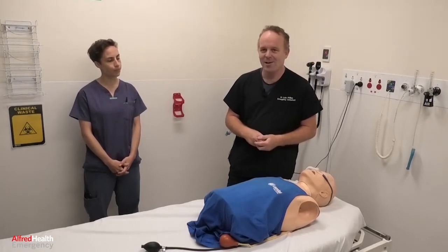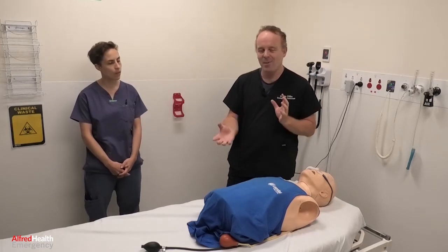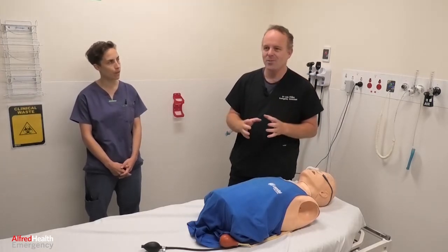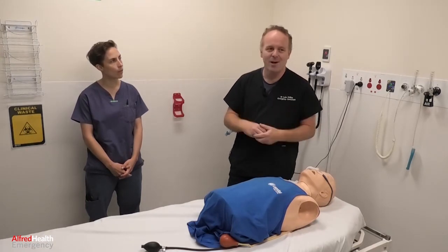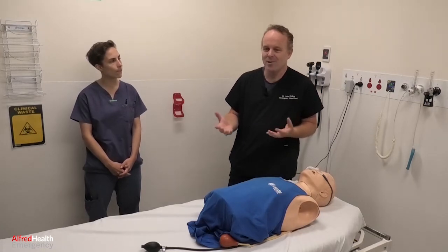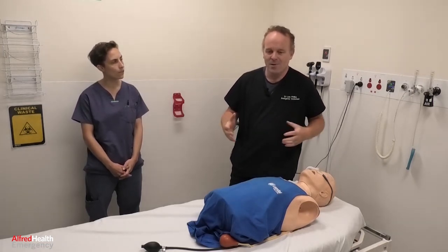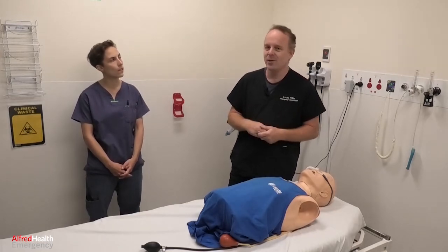So what we're going to do today is work through COVID intubation and go through some of the main differences around intubating one of these patients. The main thing is you want to protect yourself and your team members from the aerosolation of the particles that can happen. In terms of risk to you, this is probably the highest risk procedure that we're going to do on a COVID patient. The risk of generating aerosolized particles of the COVID virus during the intubation is really high.